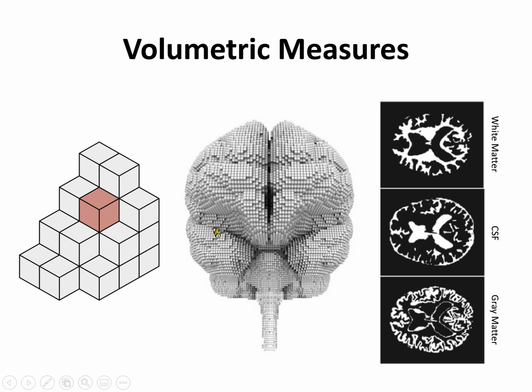The way we achieve this is to divide the brain into numerous small voxels, and each voxel is just a small cube. As I said, for the resolution of structural images, we can typically achieve a 1 millimeter cubic shape.